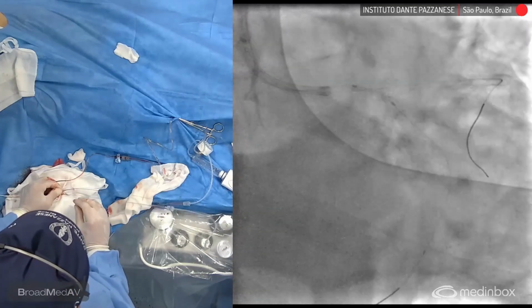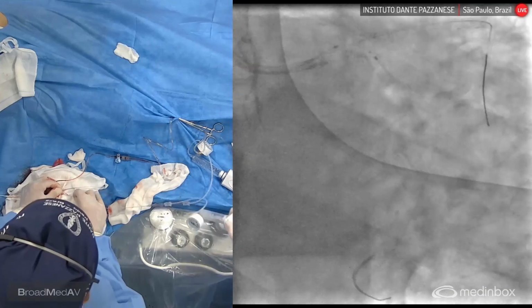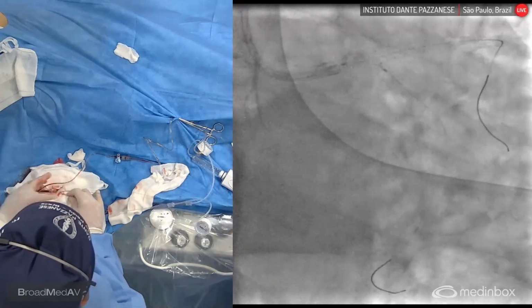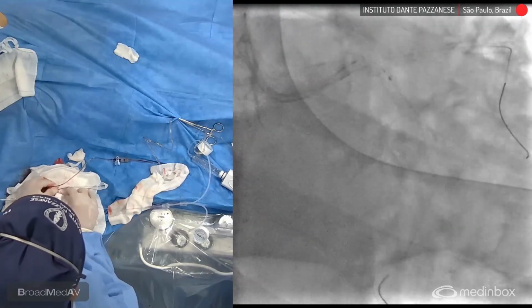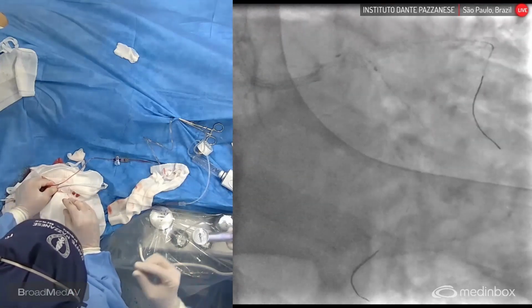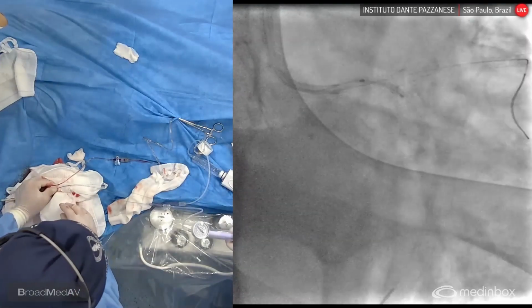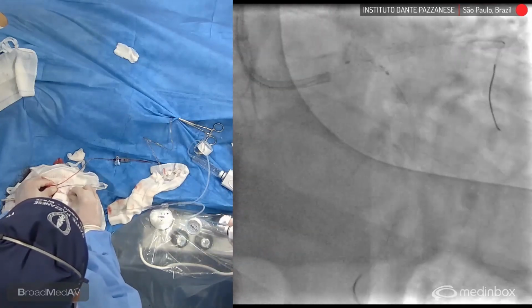any distortion effect at the left main ostium, the struts there. Trying to get more support. Okay, advancing more. So really, you see, it's like millimeter by millimeter, right, Rodolfo? Looks like a football game here. Yeah, as you try to do it.